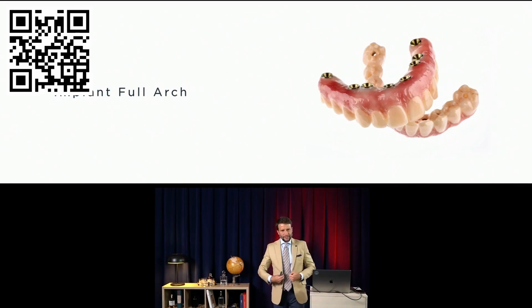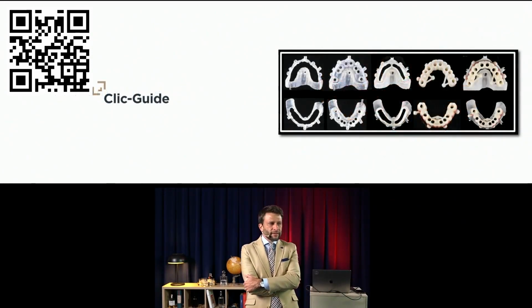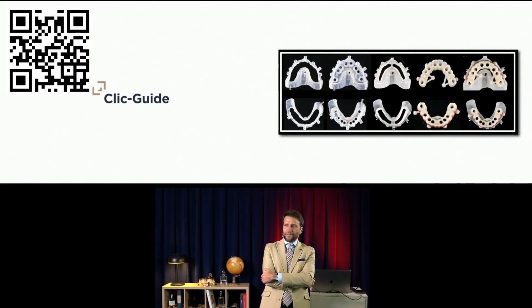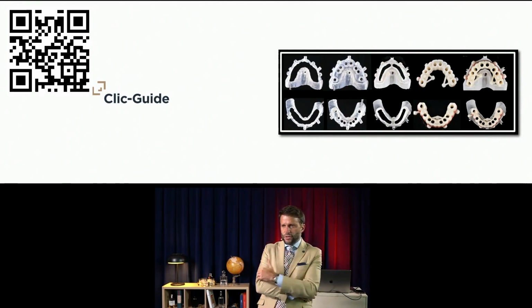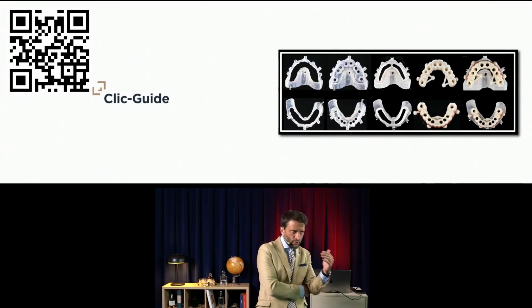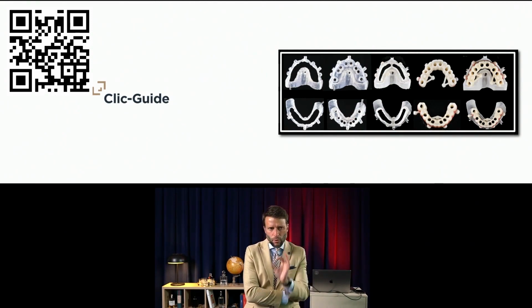Full implant arch rehabilitation. Okay? This full implant arch protocol is something that I believe is one of the things in dentistry that was most impacted by digital. It's really a must. If you do full implant arches, if your surgeon does it, if you restore, or if you do the surgical part or the restorative part, pay attention to this because it's really a beautiful workflow.